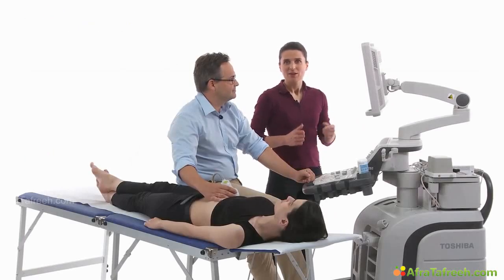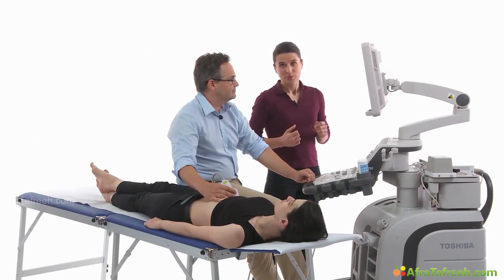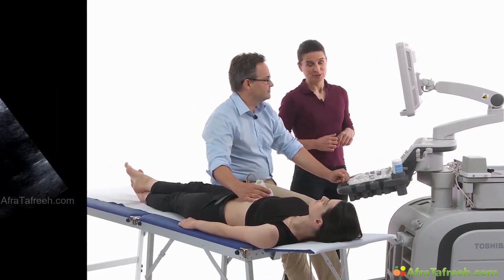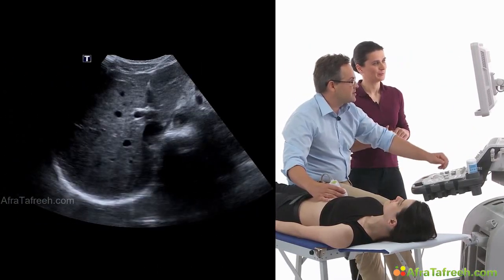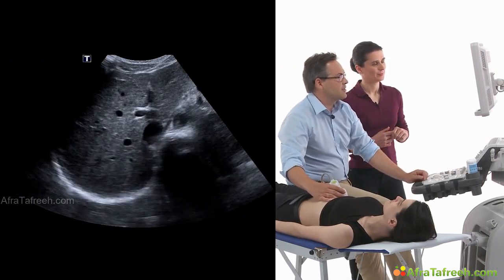In optimizing frequency, gain and depth, we already did a good job, but we can get even more information when we change the focus of the picture. Now the focus is set to the mid of the picture, so the most detailed information is given over there.